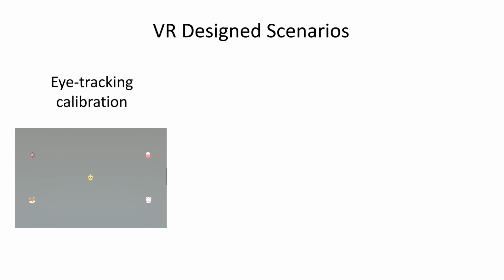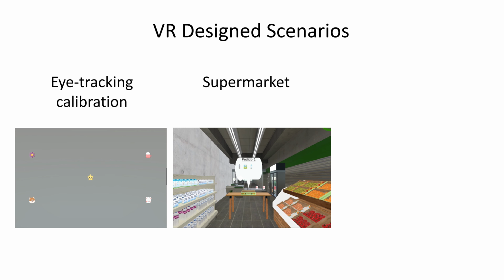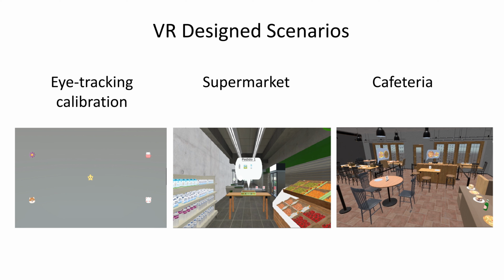The application running on the HMD includes three VR design scenarios. The first one includes a friendly and inclusive eye tracking calibration scenario. The second scenario takes place in a supermarket and involves two tasks: restocking products on shelves with empty gaps and preparing products orders. Each task has 6 levels of difficulty. Finally, the third scenario takes place in a cafeteria and involves collecting dirty dishes and serving orders to tables. As well as in supermarket scenario, each task has 6 levels of difficulty.